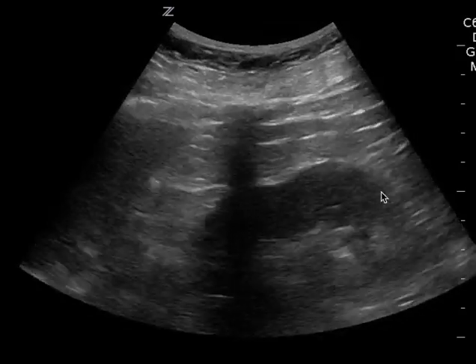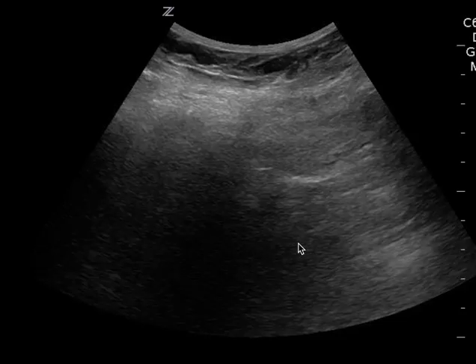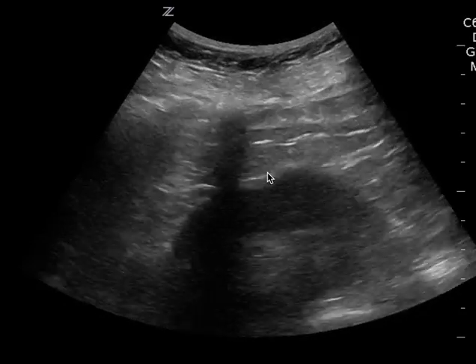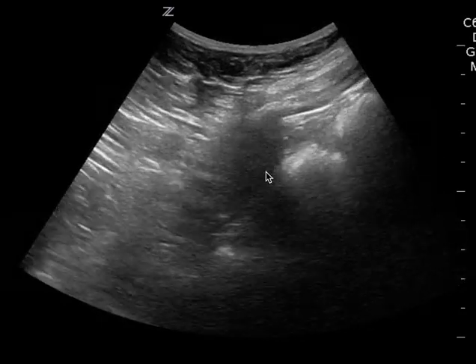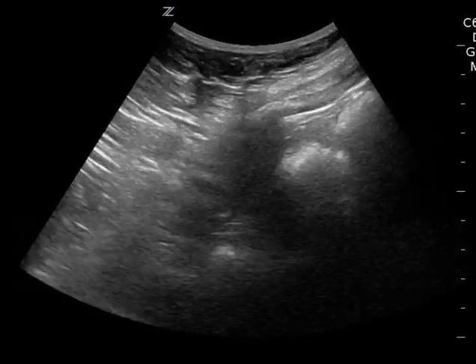This is the left upper quadrant — kind of the same thing. Your depth is too superficial. You can see the kidney but you don't see much of the splenodiaphragmatic space. I would have increased the depth and also moved a little bit more towards the axilla.